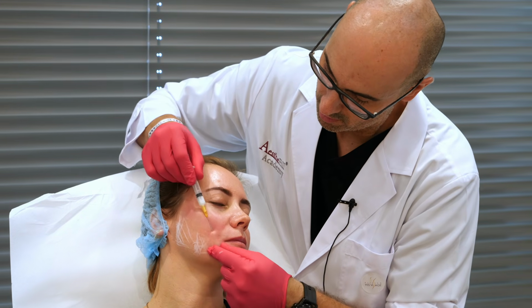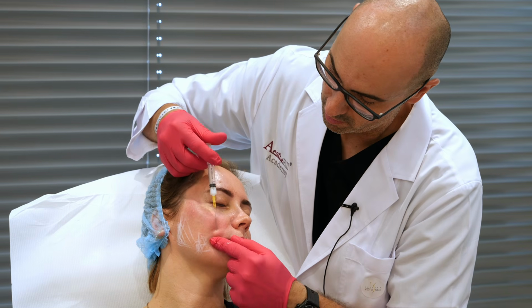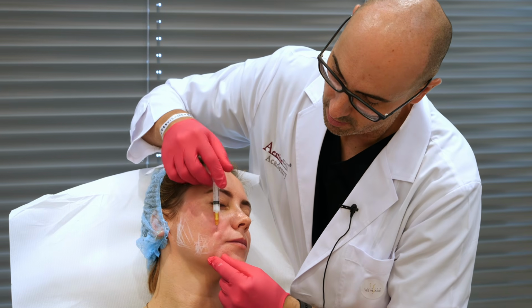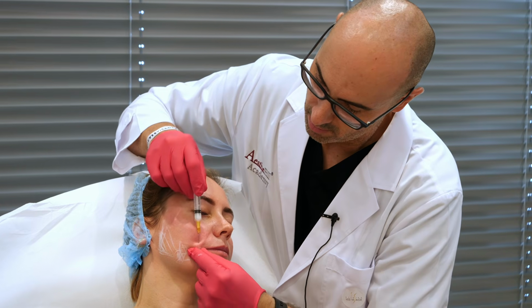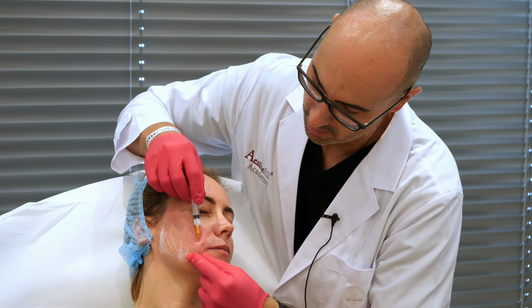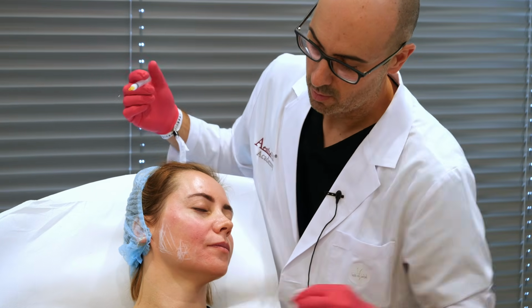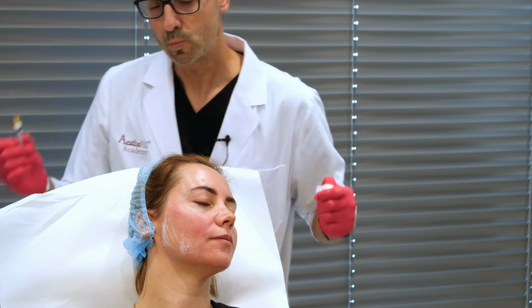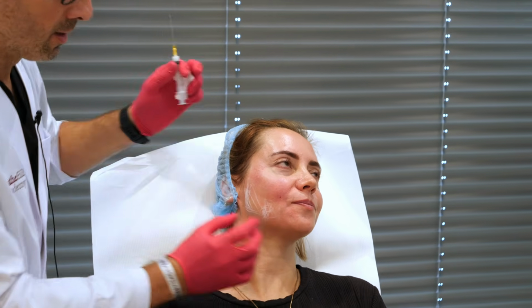And I put another two vectors, about 0.1 in each vector. Okay? Right.